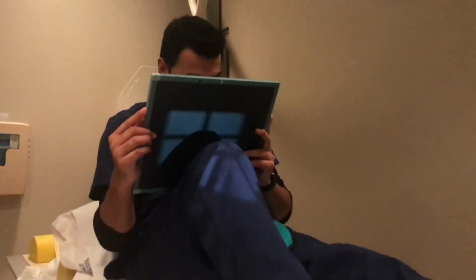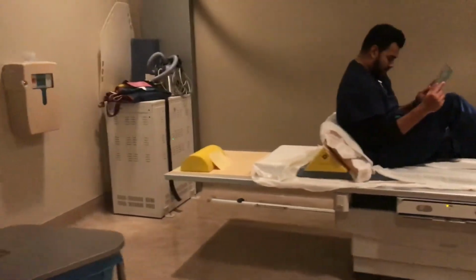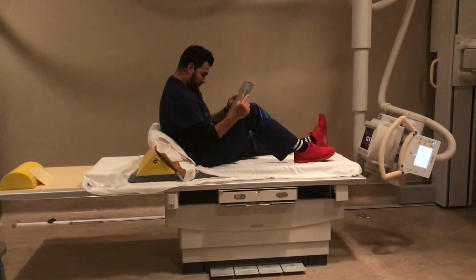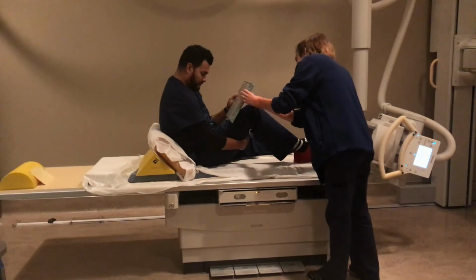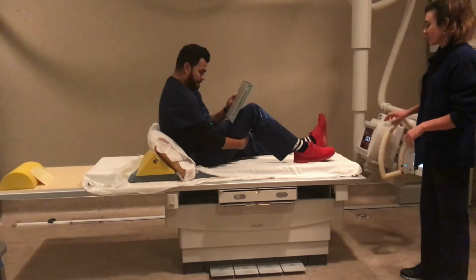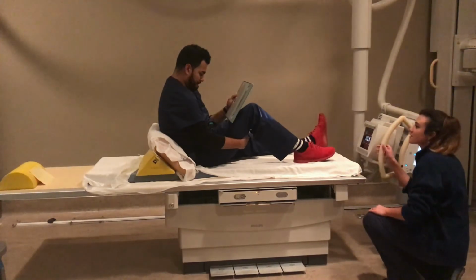And so that's pretty much what it looks like right here. Alright, and so I'll put my marker on the cassette. And that looks good. And so the CR, the angle's not, like I said, with the long axis of the leg. Yeah, that looks good right there.